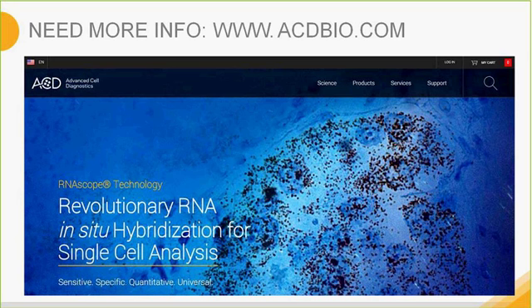A similar question is, if I have 2.0 detection kits, can I use them with the new 2.5 pretreatment reagents? The answer to this is that for chromogenic red and brown, we specify that 2.5 pretreats should be used with the 2.5 detection kits. However, our 2.0 multiplex and 2.0 duplex can also use the new pretreatment reagents. Please consult the pretreatment matrix on the web.